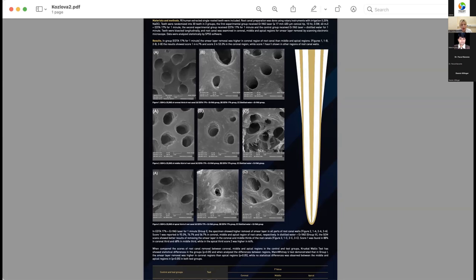Using irrigants and chemical agents alone doesn't achieve this goal due to the inability of these agents to eliminate the microbes and remove the smear layer and debris from the root canal walls. About 30 to 45% of the root canal surface remains untouched by mechanical instrumentation, because nature is very clever. So the role of using irrigants is to compensate for this problem.